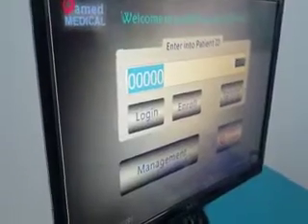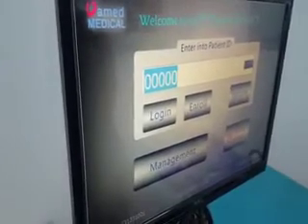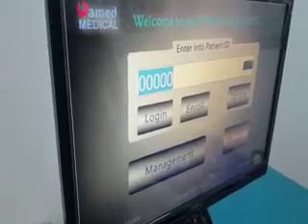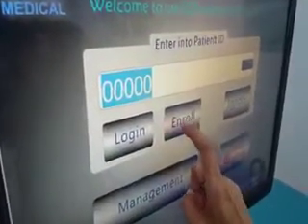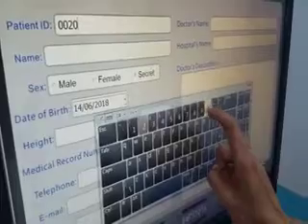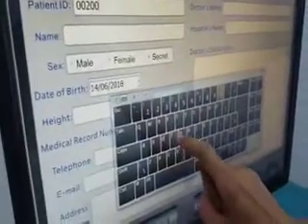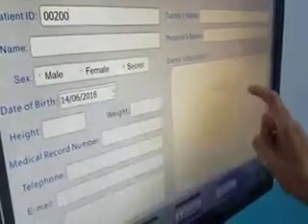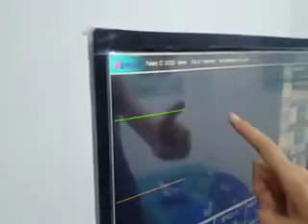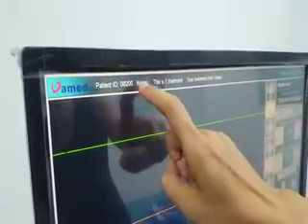When a new patient comes to accept treatment, we need to enroll them. We enroll the new patient by giving an ID number — for example, 00200. You can use the software keyboard to input additional information. After finishing, press Submit to enter the treatment interface. You can see the patient ID number 00200 is displayed, just as we entered.